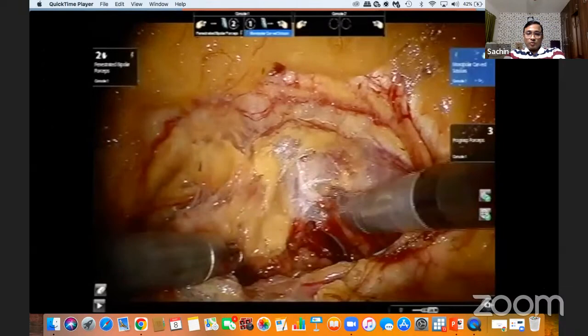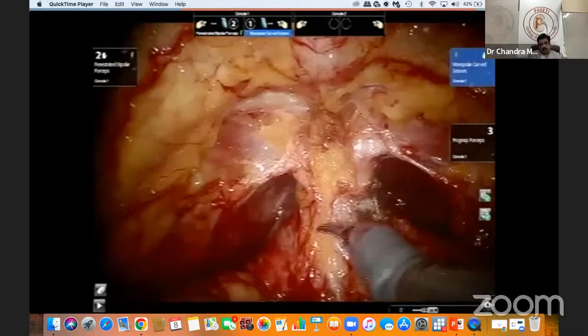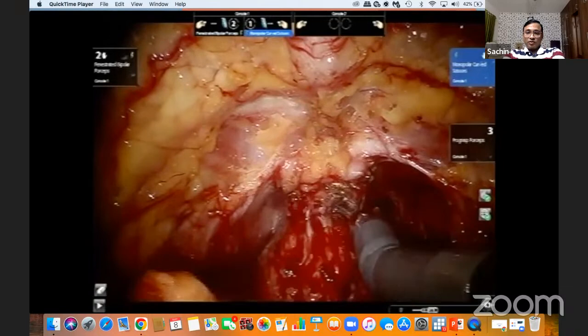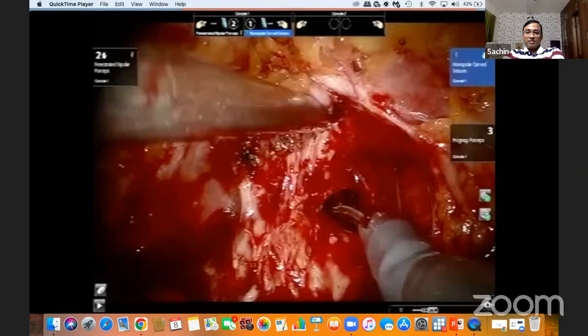So once we reach the prostate, we dissect the apex. The rest of the attachment of the neurovascular bundle on the left side, anteriorly, has been separated. I cut the DVC cord to get the maximal urethral length, as I'm planning to do a neobladder in this case. So there will be some bleeding. Irrigation is sufficient. One should not suck when we are doing DVC. It bleeds more.